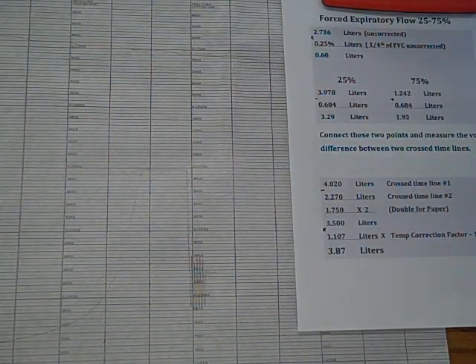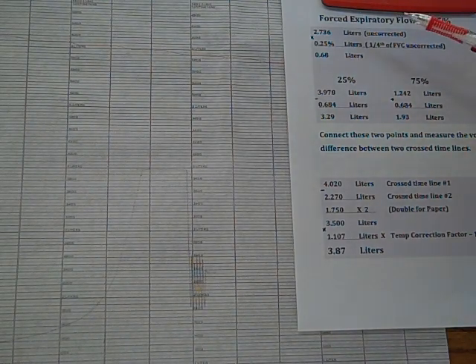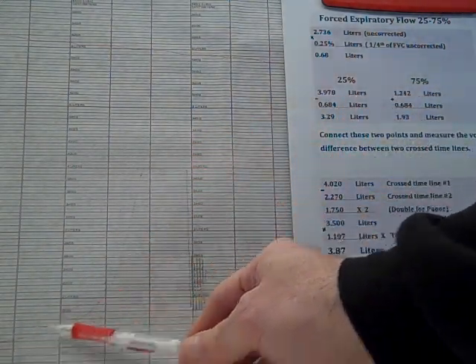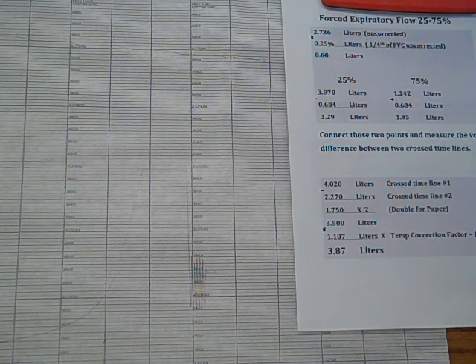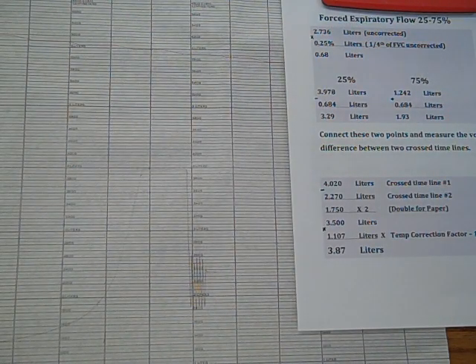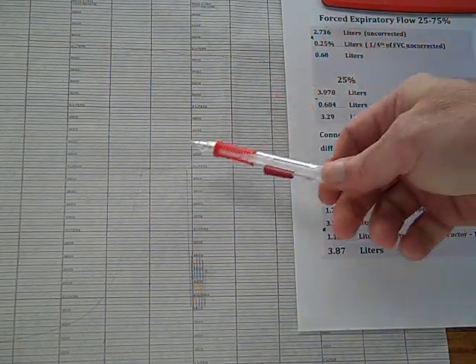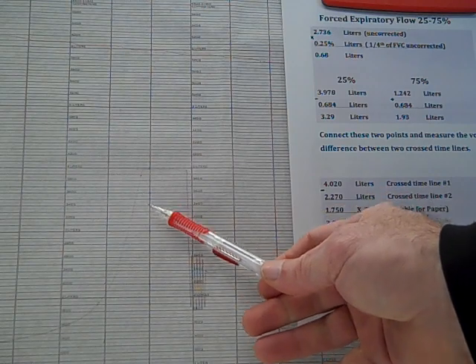Forced expiratory flow from the 25 to 75% range. On this one, we're going to figure out what our total vital capacity was from the top to the bottom, which was 2.736 liters. We don't have to do all of the doubling for the paper or the temperature conversion yet, but we're going to take 25% of that value from here to here, and we're going to put a point there.